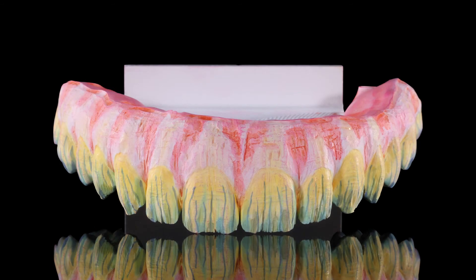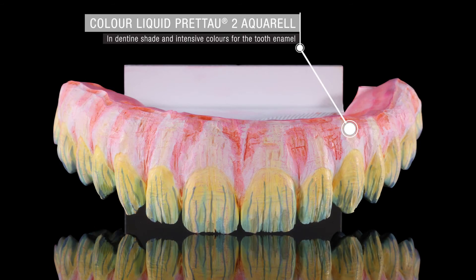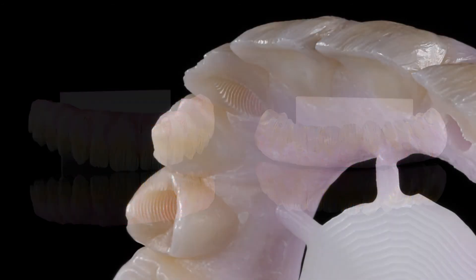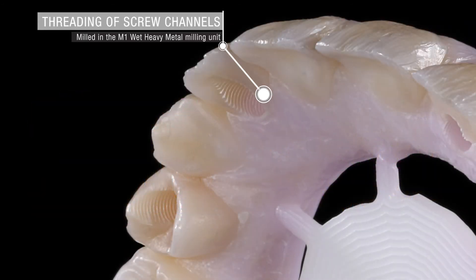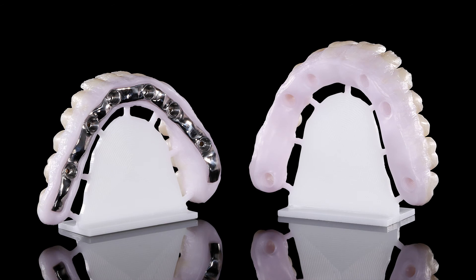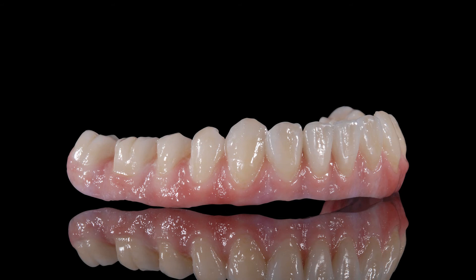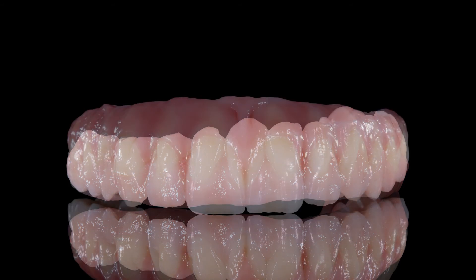The final restoration was milled in Pridot 2 zirconia and characterized with color liquids — Pridot 2 Aquarel. The screw channels were threaded into the zirconia structure during the milling process.